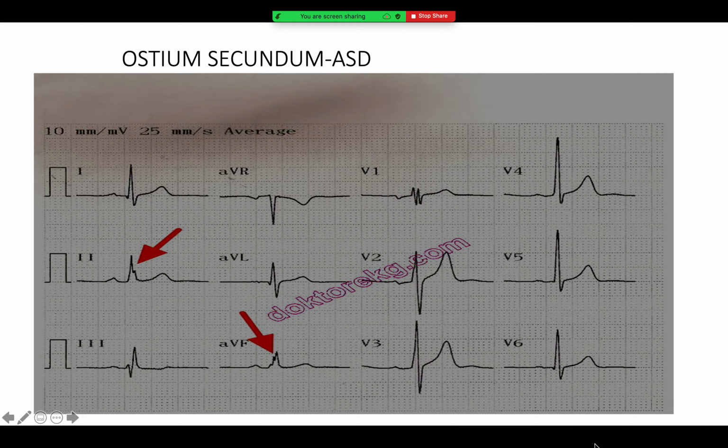Or the QRS as well? The P wave looks slightly broader, isn't it? If you notice, it does cover a small box at least, especially in lead 2. And how about the QRS? There are some arrows which have been put up to make it easier for you. So the QRS is definitely prolonged.